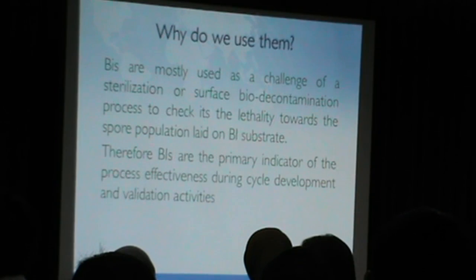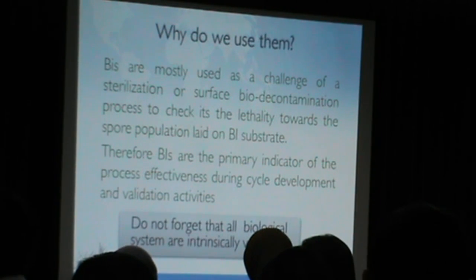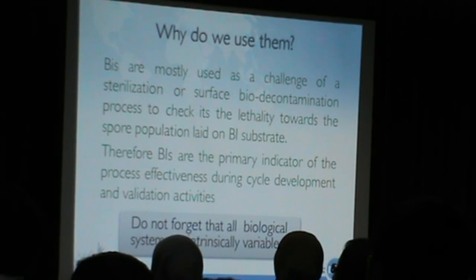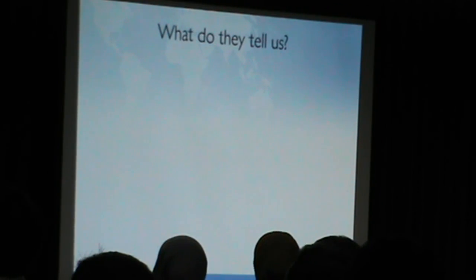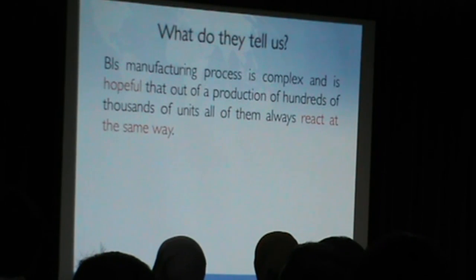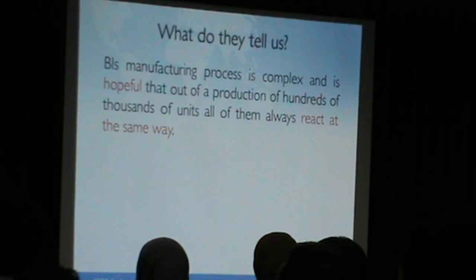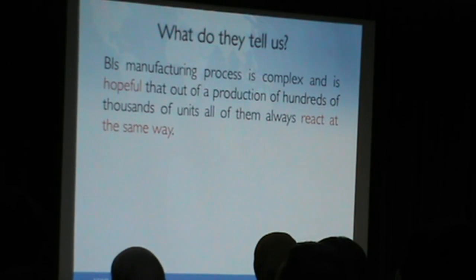But don't forget that all biological systems are intrinsically variable. So the BI's manufacturing process is complex, and it is not certain that out of a production of hundreds of thousands of units, all of them always react in the same way.